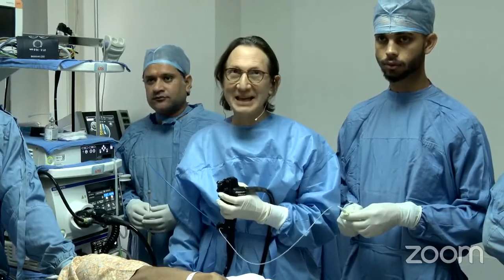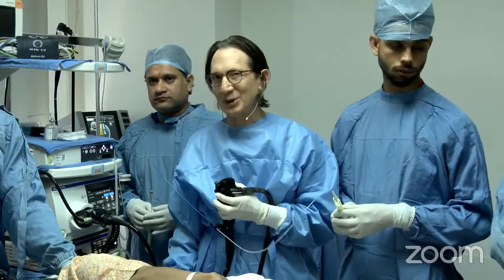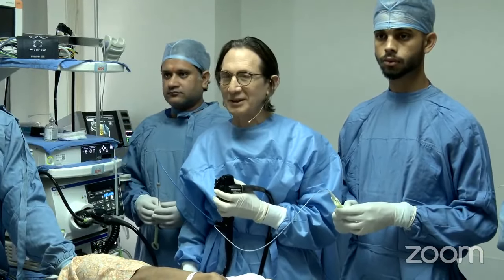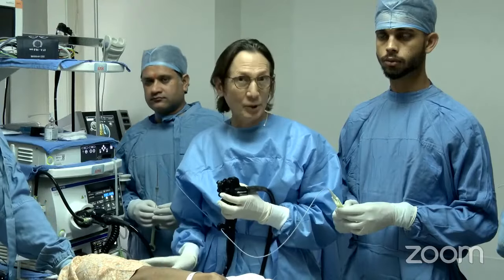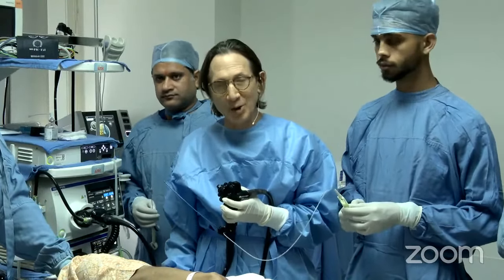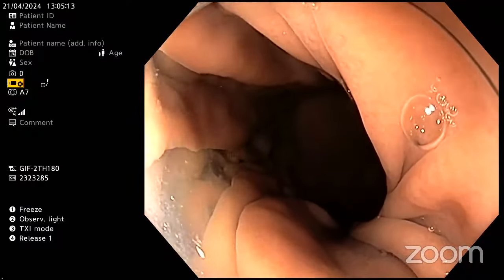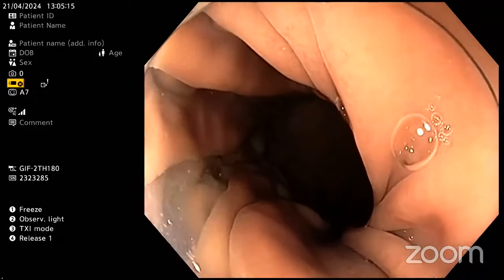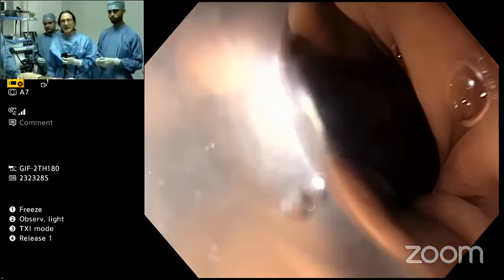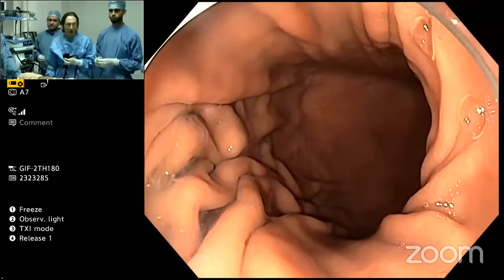Well, I guess that probably would be where I would start, first with an endoscopic ultrasound to better characterize this lesion. It looks like a subepithelial lesion. This is a double channel scope. You saw it used yesterday for removal of the leiomyoma in the sigmoid colon. I'm going to use it again. I think the double channel scope is vastly underutilized and underappreciated. Hence, it's really a pleasure for me to be able to emphasize its value in endoscopy.